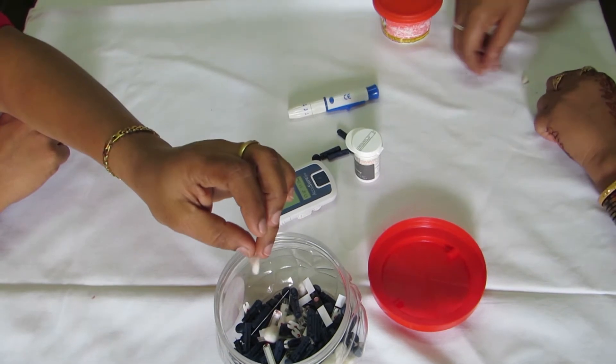Disposal of the Spirit Swab. Take the used swab and drop it in the box.